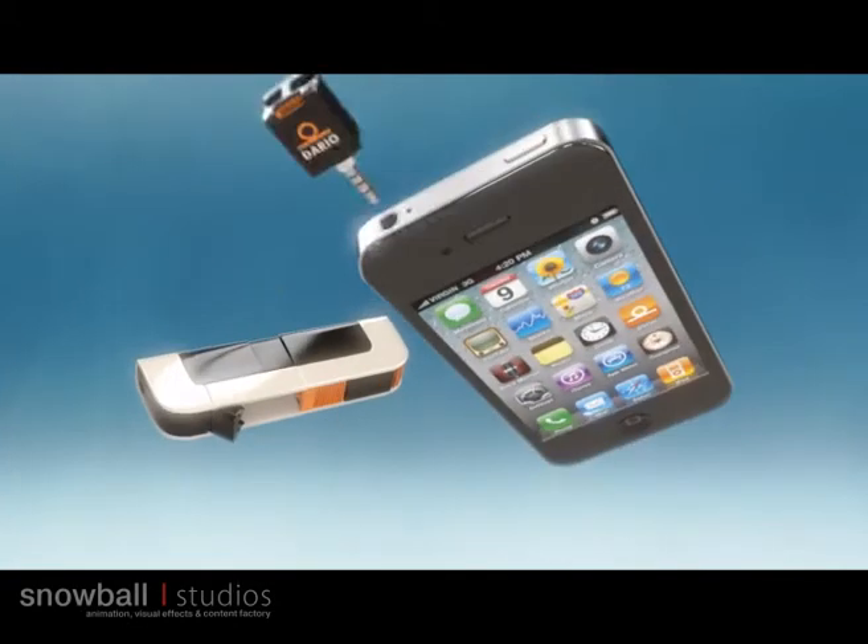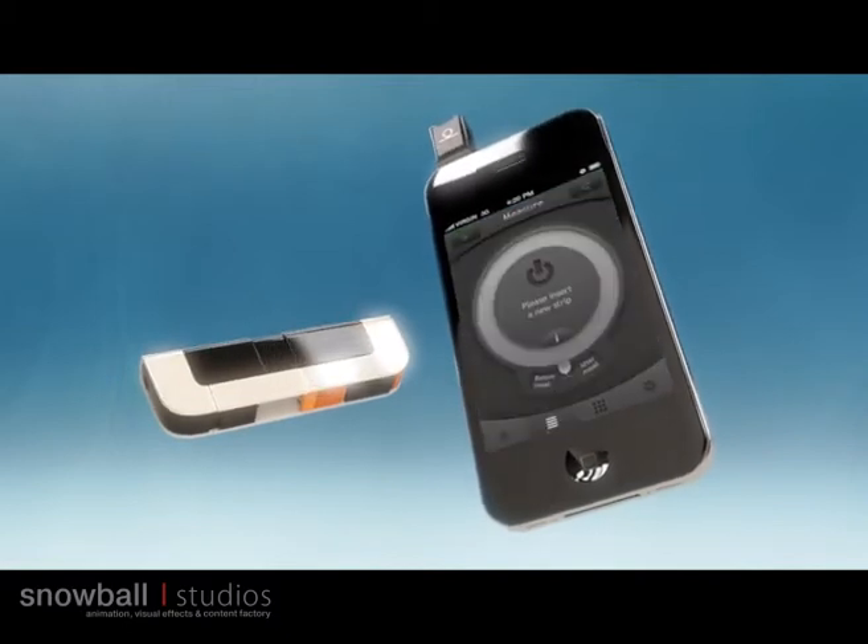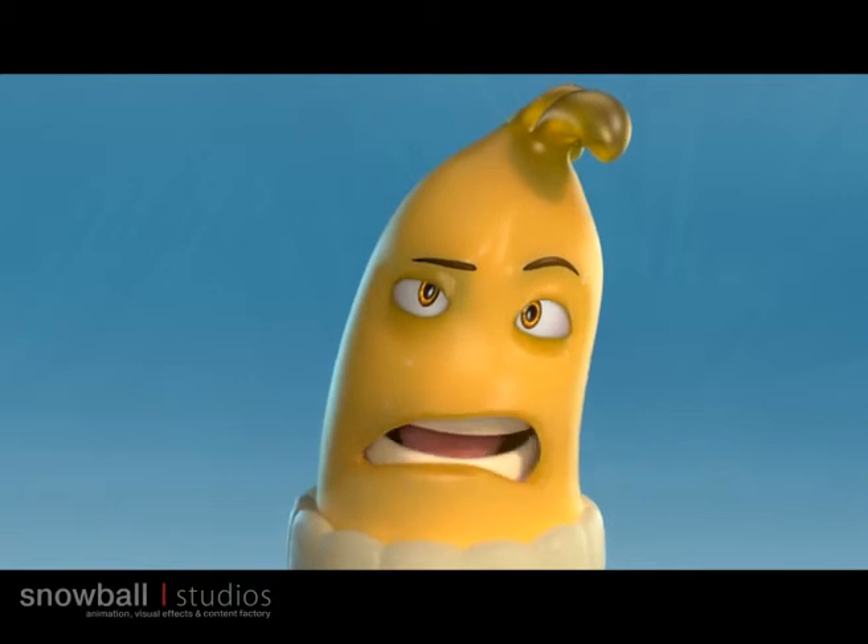Connect the meter to the audio socket on your smartphone and activate the Dario application. Is that easy or what? Si, senor. Are we a cha-cha dancer?